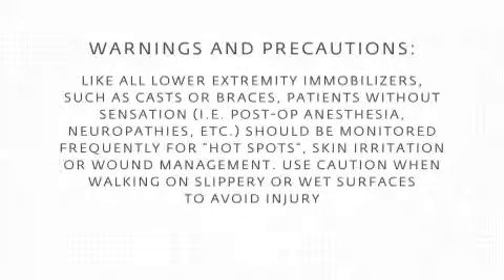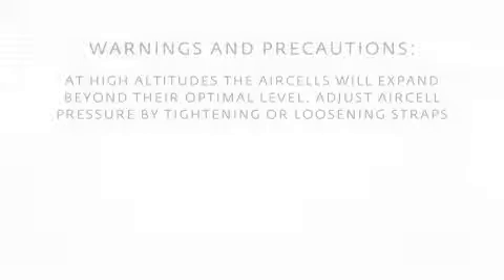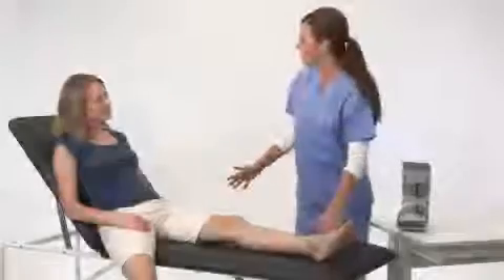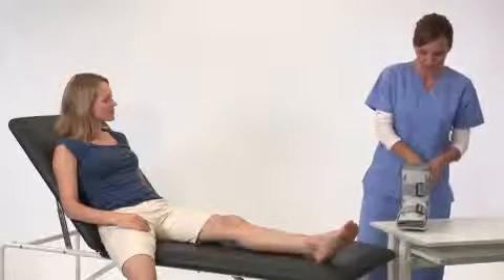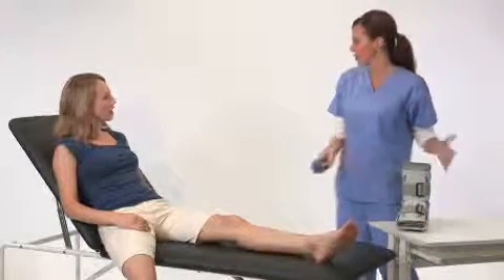Let's get started. Your SP walking brace includes an inflation tube. You may want to wear a cotton or cast sock for enhanced comfort.